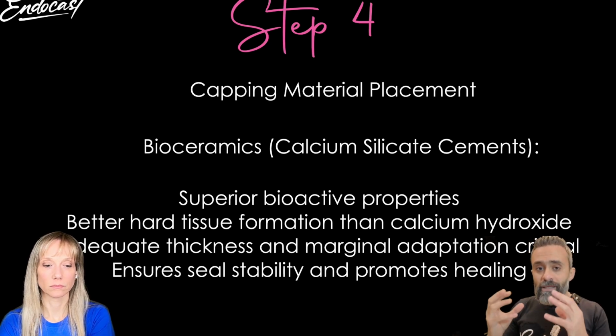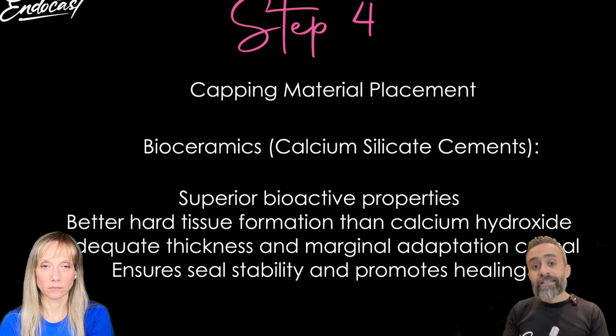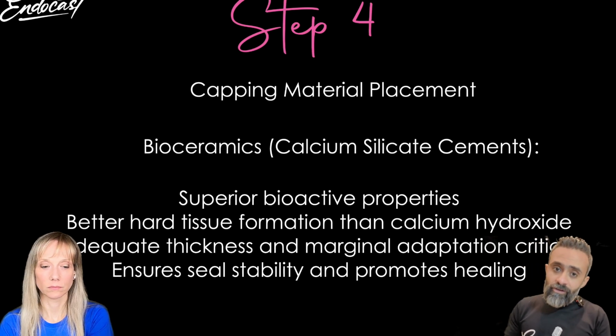So now we can place a pre-mixed calcium silicate based material like the bioceramic putty, and we use the dedicated carrier to deliver the material over the pulp stump.